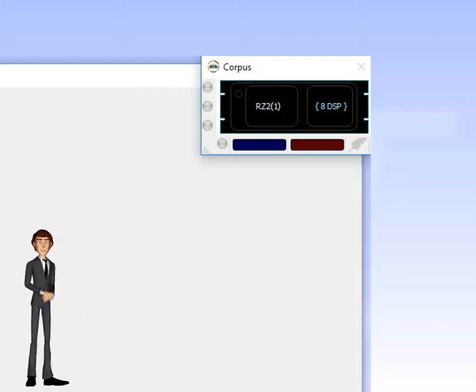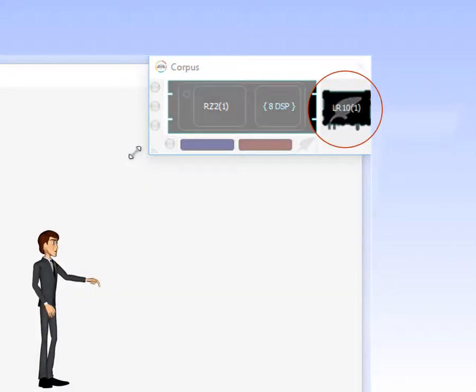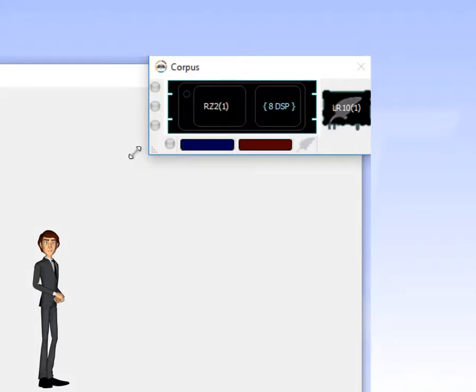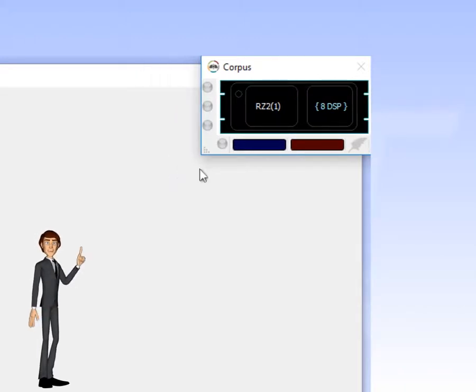Corpus is also the program that communicates with the LabRat device. Drag here to see the LabRat device connected to the emulated RZ2 DSP processor. Appreciating that LabRat connects to Synapse through Corpus is important to understanding how signals are accessed from the Synapse software.